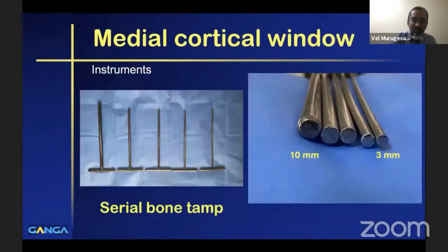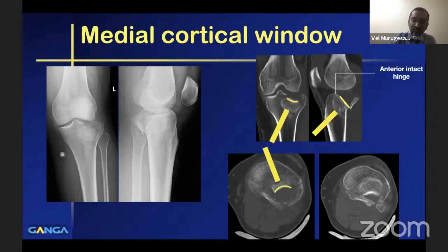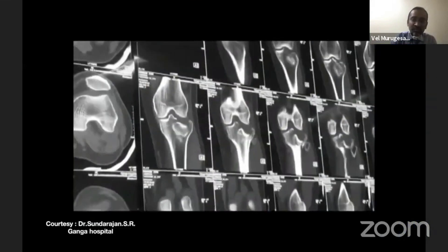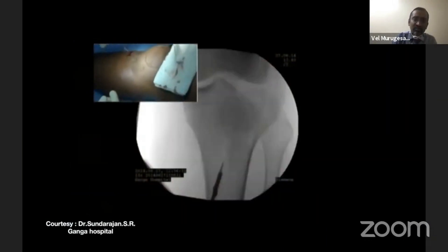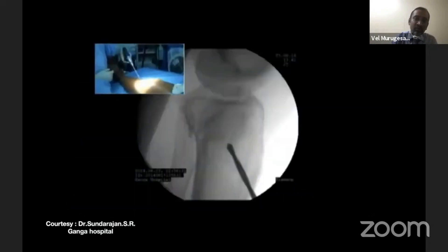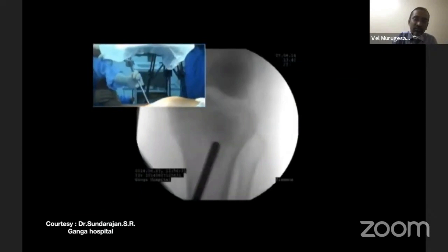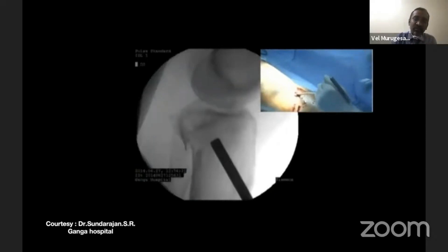In the medial cortical window technique, we use a series of bone tamps with varying sizes from 3 mm to 10 mm. In this case example, there is an intact anterior hinge. The aim is to get the elevating rod perpendicular to the articular surface and to the center of the depressed fragment in all planes. We make an incision, create a pilot hole with a 4–4.5 mm drill bit, and serially enlarge the hole using bone tamps starting at 3 mm up to 10 mm, placing it at the center of the depressed fragment and then elevating it.